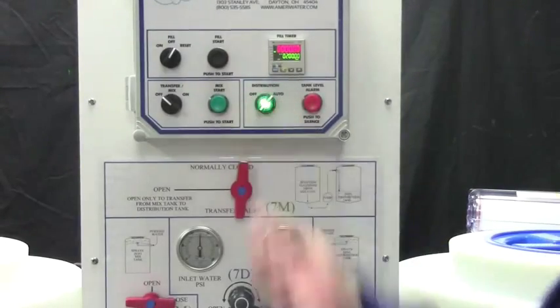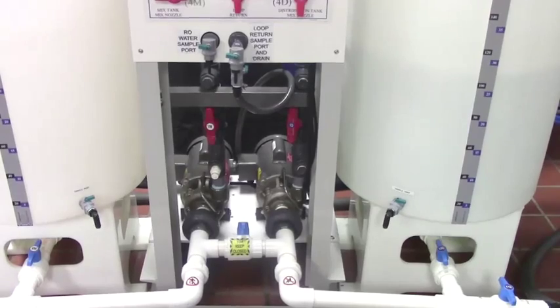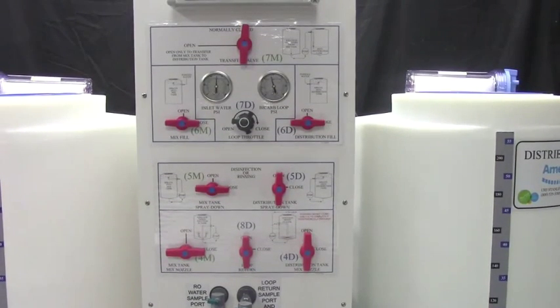Turn the distribution switch to auto and allow the system to recirculate overnight with valves 1D, 10D, 4D, 5D, 7D, and 8D open.